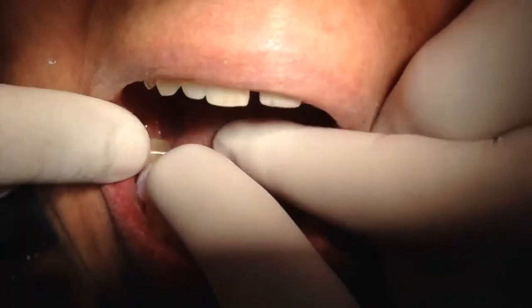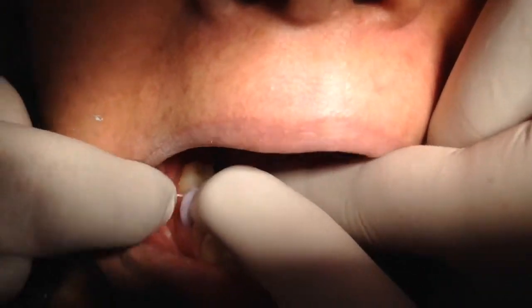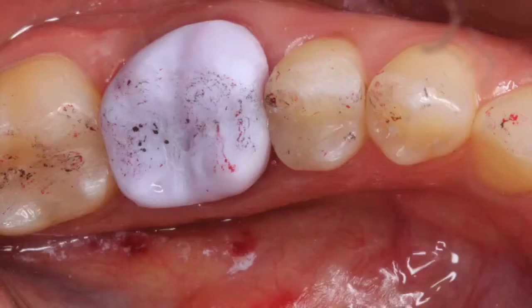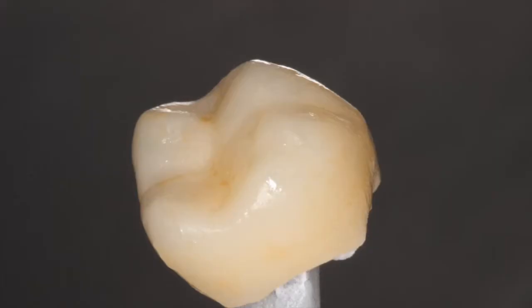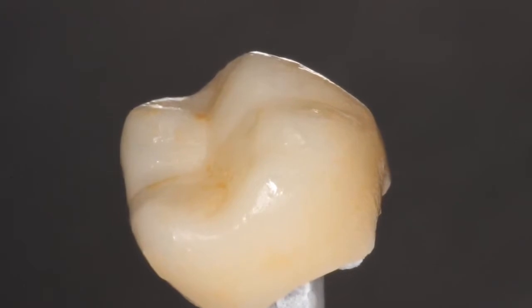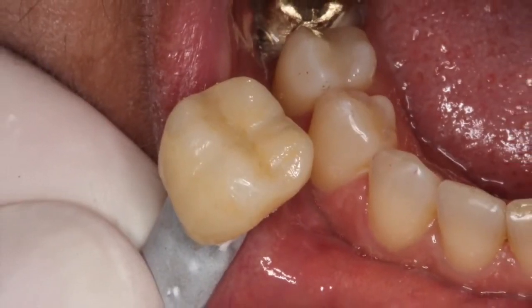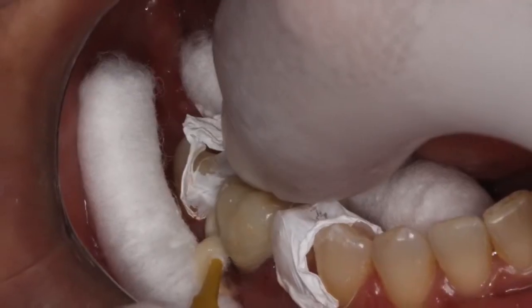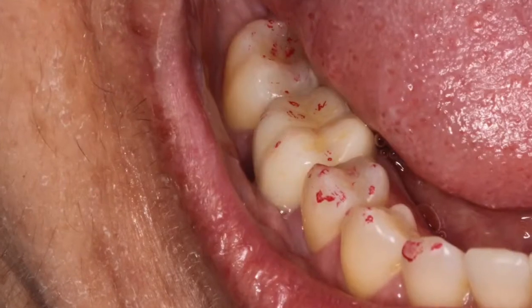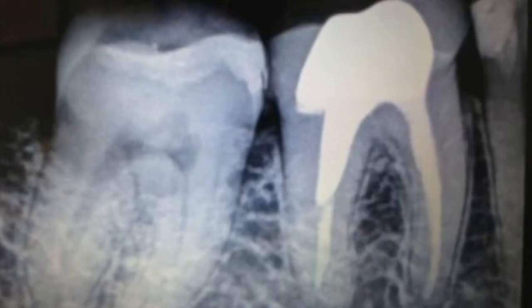After the milling, it must be crystallized at a specific time and temperature. Then, it will change to a color similar to natural teeth, and can also go through the process of makeup. After the glaze, the process continues with conventional steps for fixing the crown with resinous cement.